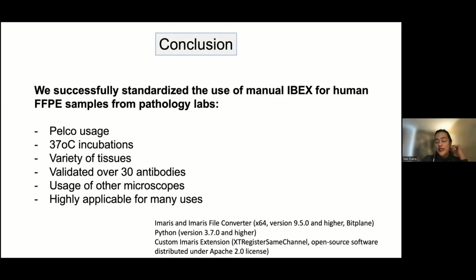Hopefully, in next year's presentation, I can show you some of the data that we've got from this. The bottom line here is that, yes, you can use this. You can use just one slice and do many different cycles using fluorescence, and that will allow you to stain as many different markers as you have antibodies that can be employed, or even different molecules that can be employed here.